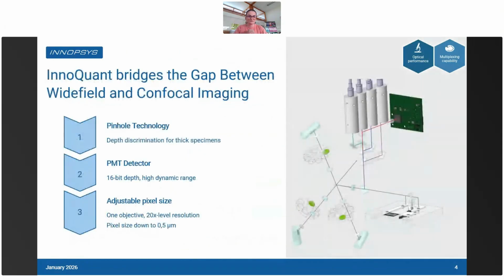So here you have a more detailed drawing of the inside of the instrument. So we are using laser for excitation. And then, as I was just saying, we are also using PMTs as detectors. Yes, so our slide scanner has confocal capabilities, which are also enhanced by a small pinhole that we do have in front of our PMT. Yes, so we are scanning with our 4 lasers simultaneously and then collecting the emission beam, and each emission is detected by its right PMT.